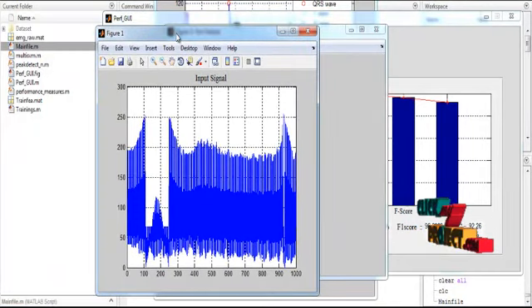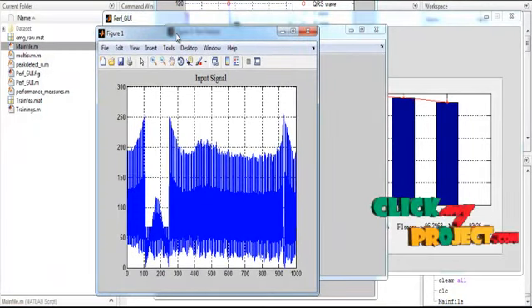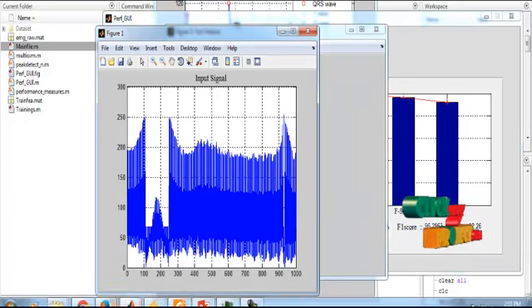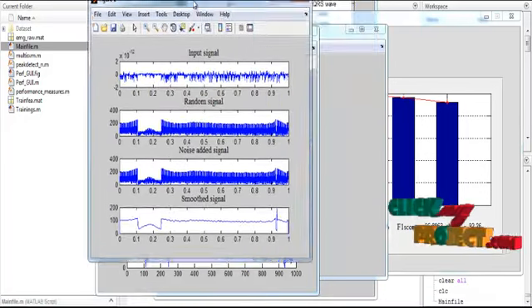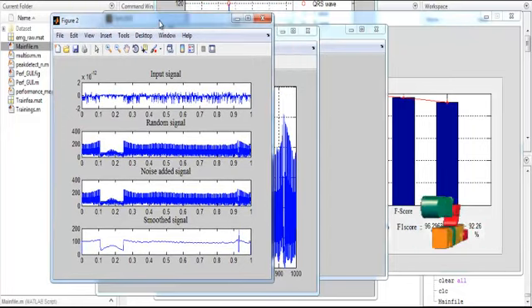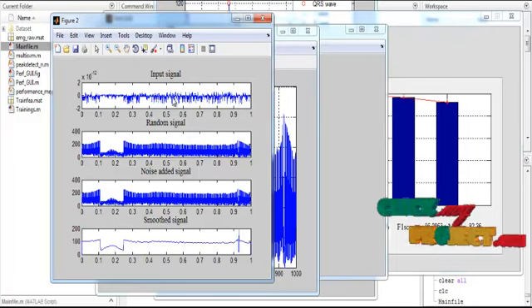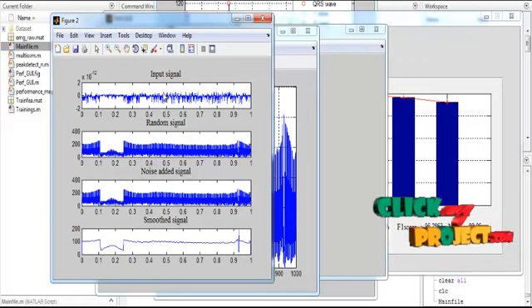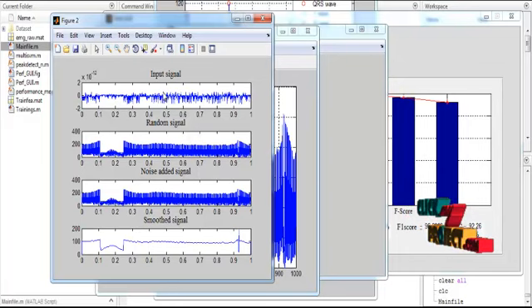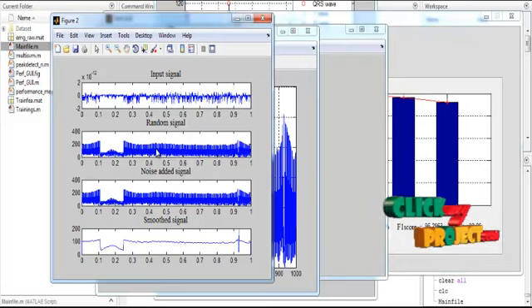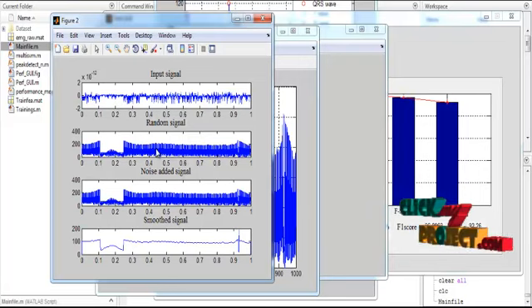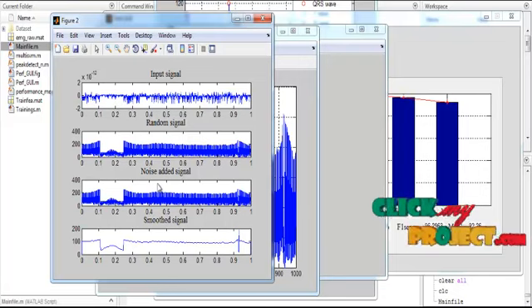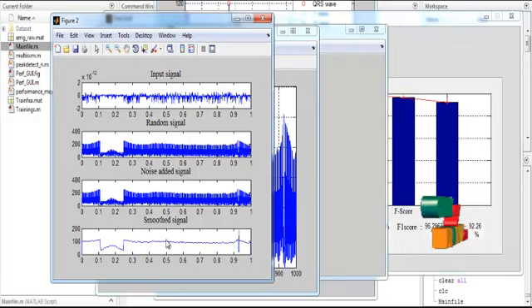Figure 1 represents the input ECG signal selected from the dataset, shown in the range of 0 to 1000. After the input signal is selected, signal smoothing is performed. Figure 2 shows a subplot of the input signal, the random signal, the noisy added signal, and the final smoothed signal. The random signal is generated based on random values of the input signal, the noisy signal adds those random values to the input, and the smoothed signal is the final filtered result.